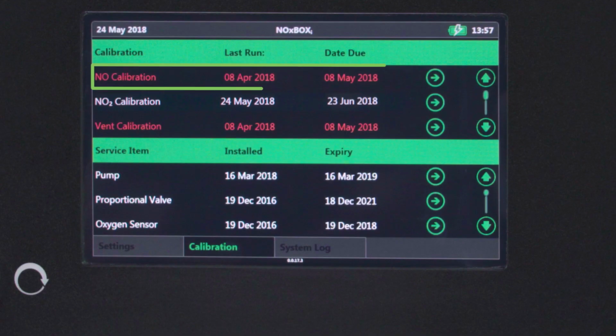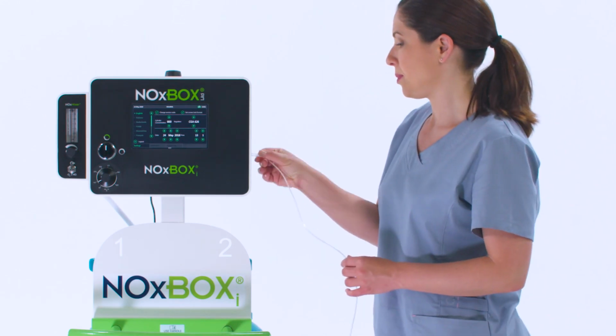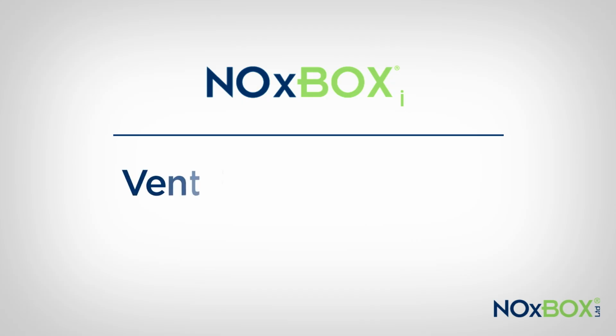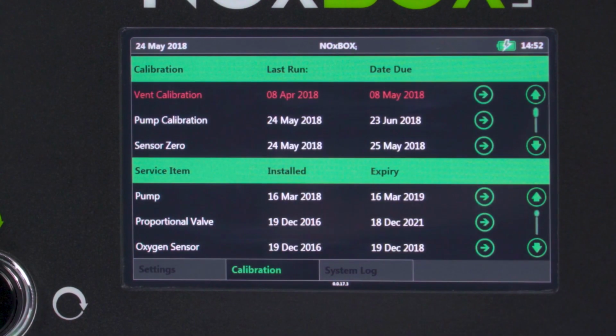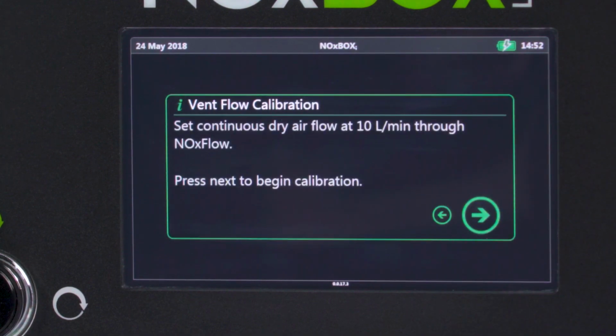Next, calibrate the nitric oxide sensor following the same procedure. Once both the nitrogen dioxide and nitric oxide calibrations are complete, remove the hydrophobic filter and place it into storage. Finally, to perform the vent flow calibration, press the on-screen calibration tab and select the respective arrow.